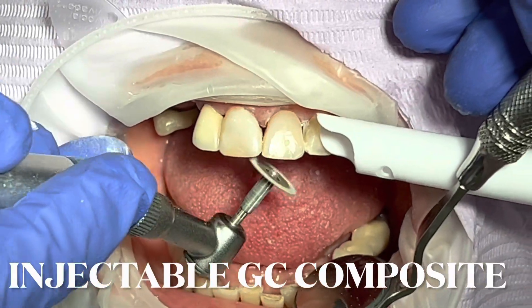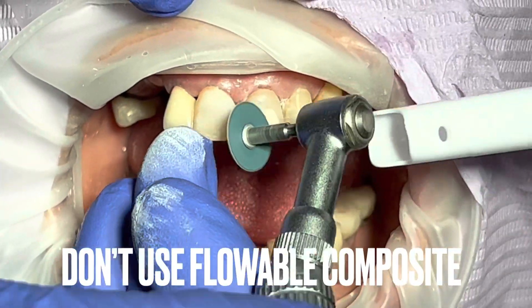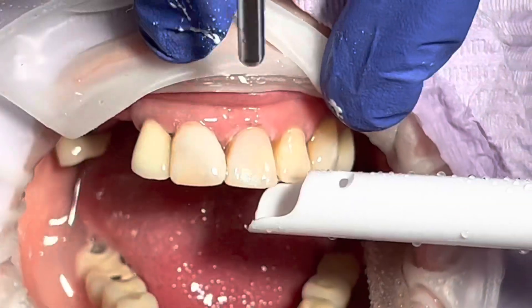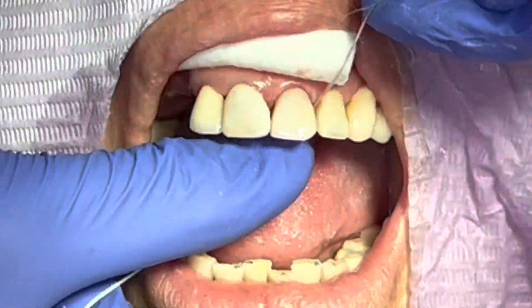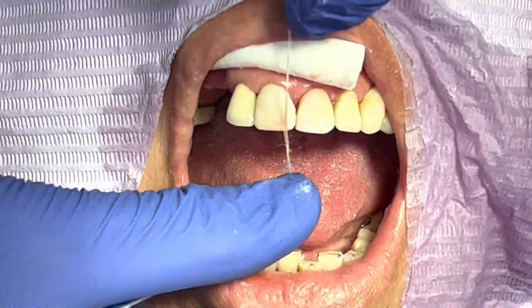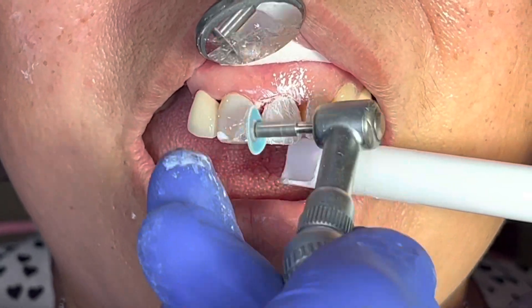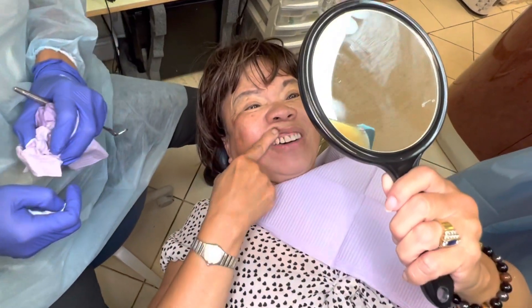If you are good at doing composite veneer, you can be extremely fast with this technique because it saves a lot of the handskill that a typical experienced dentist would require. The template helps you a lot already. For minor things like mesial-distal contact, you can fill it in with a regular technique. Anyway, the patient said she could tell she had a problem before but now it looks great — very good result.